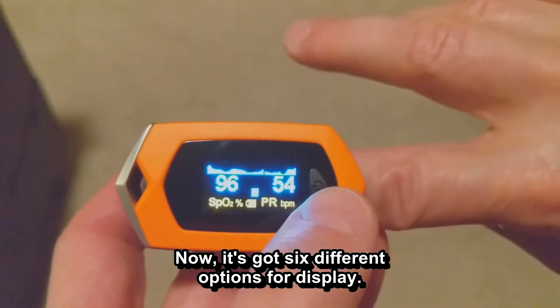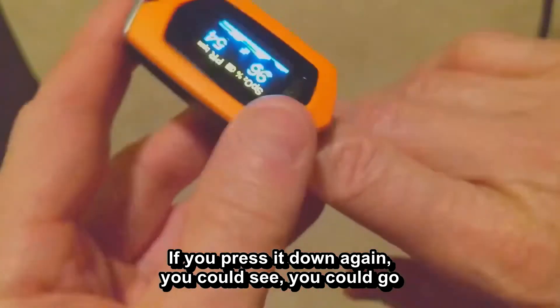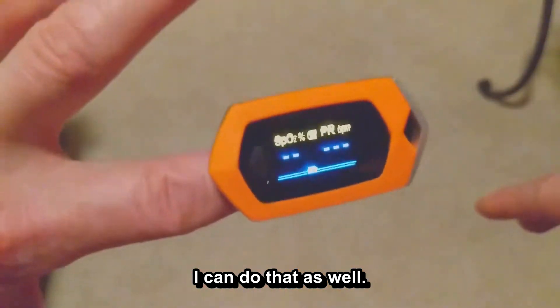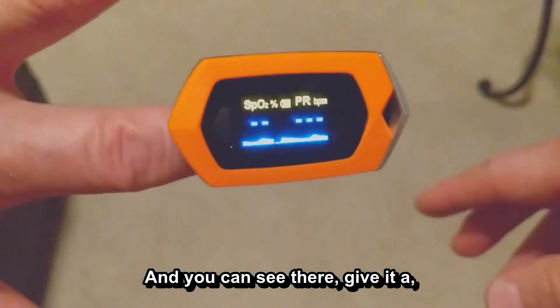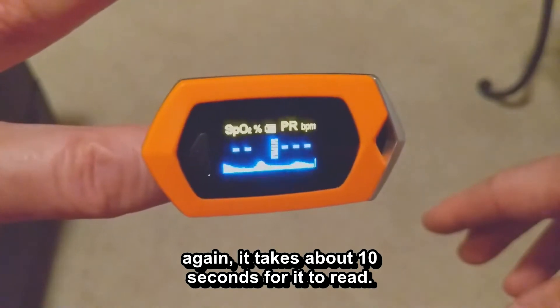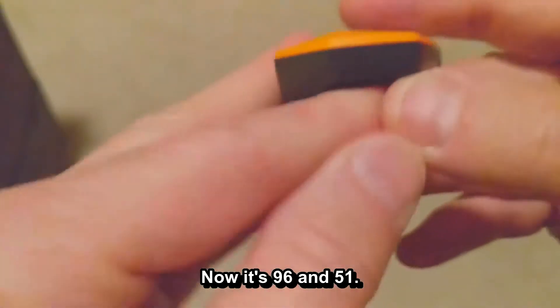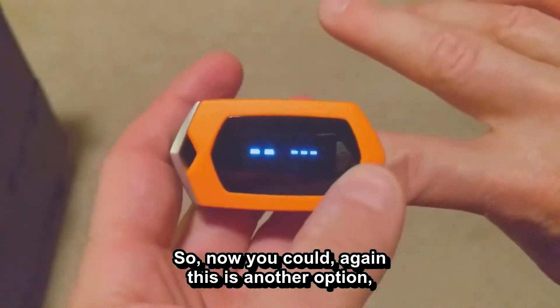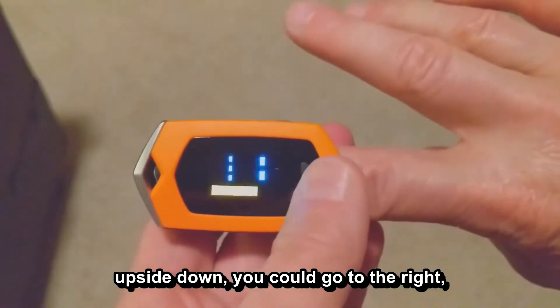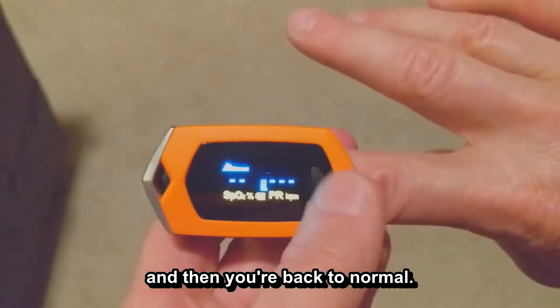It has six different display options. If you press the button again, you can also switch fingers — I can put in my left finger as well. It takes about 10 seconds to read, and now it's at 96 and 51. You can also rotate the display — upside down, to the right, to the left — and then back to normal. Those are the different screen options.